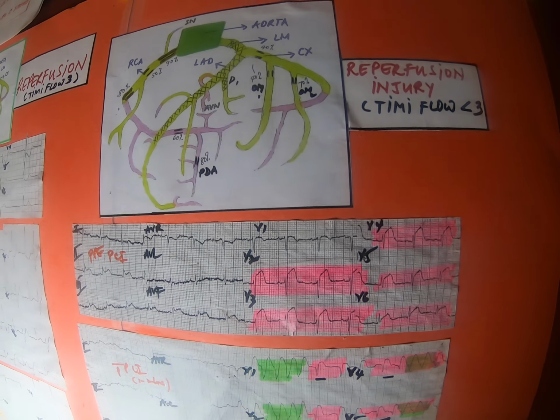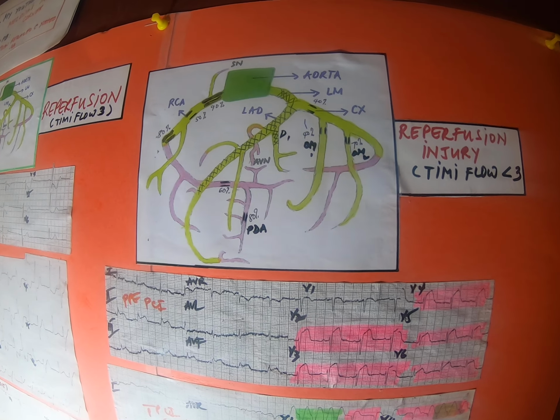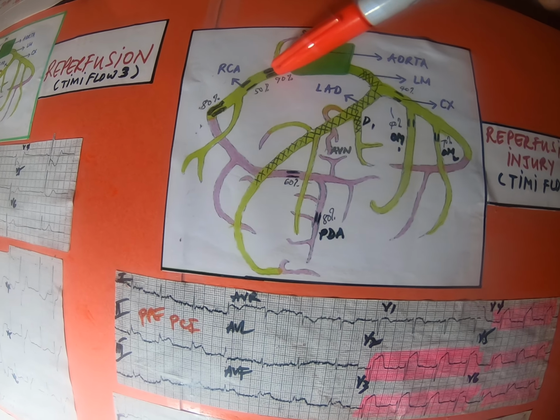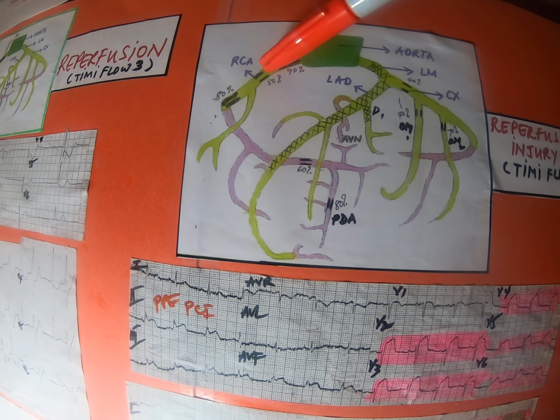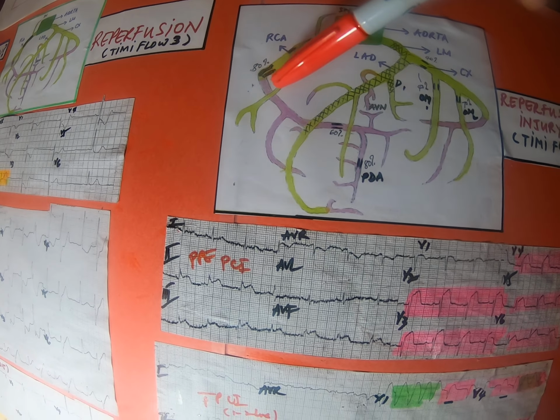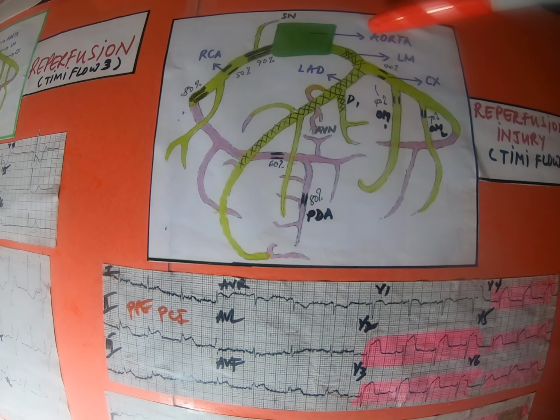So the patient went to the cath lab. The interventionalist did an angiogram, and this is what they saw. We have a 3-vessel disease. The RCA is 90% occluded proximally, medially it is 50%, going distal it is 80%, far distal is 60%, and the PDA is 80%.